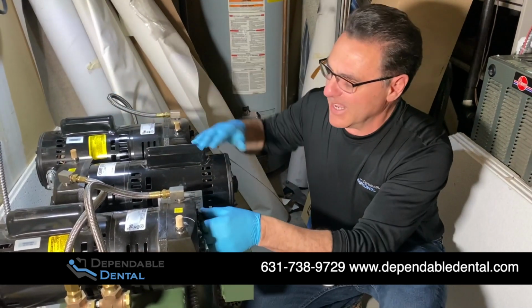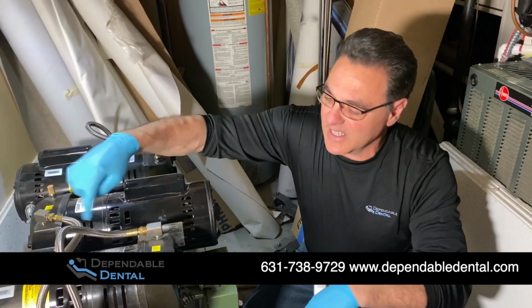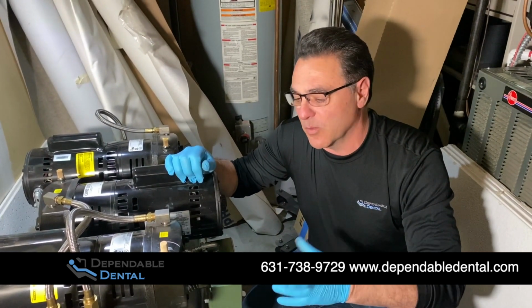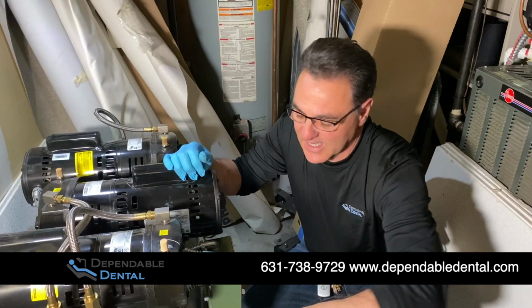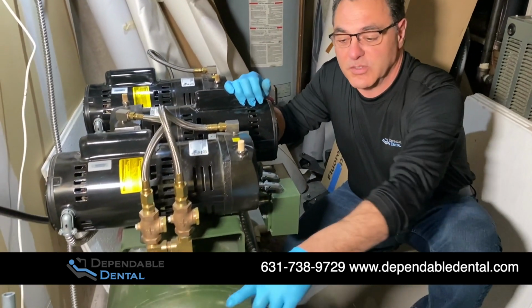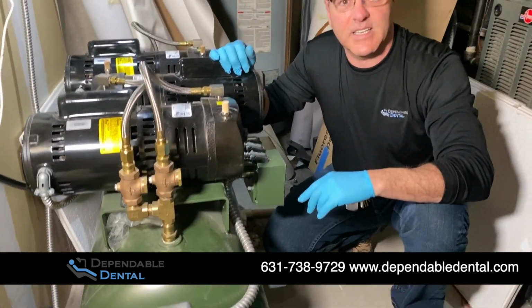If you're going to give the heads a light wipe down, make sure you do not spray anything into the heads. The motor windings are in through these access holes, so you want to wipe it down with a dry cloth or dry paper towels. You can spray the tank, that's okay. Right here is your pressure switch. It should go on at 13, off at 20. There are plenty of videos online showing how that is adjusted.